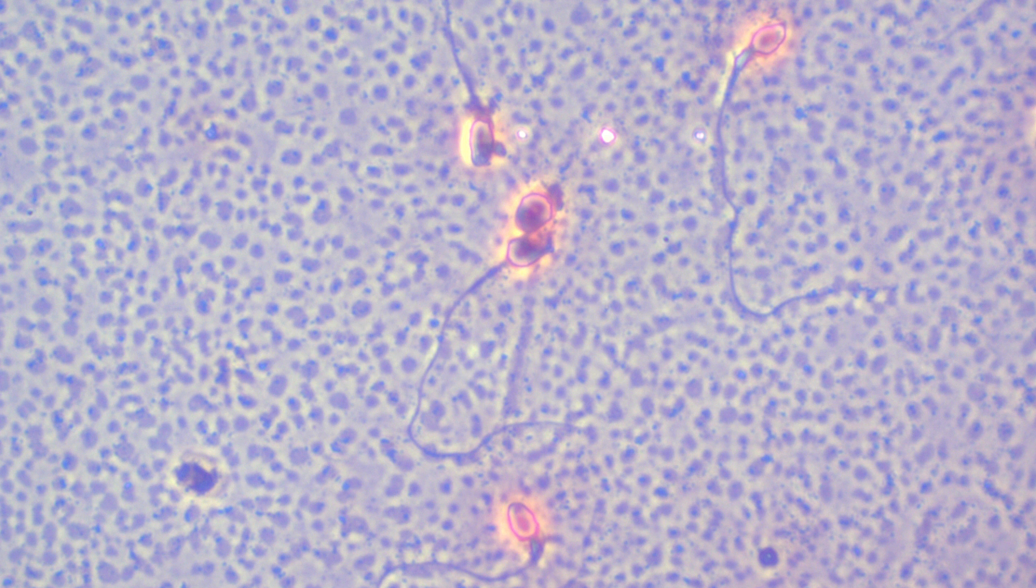Finally we can have a look at the cells in detail and you can see what the staining has done. We have this nice blue and red colors which makes it quite easy to differentiate between the heads of the sperm cells, the mid pieces and the tails. In conclusion none of those sperm exhibit a normal morphology.